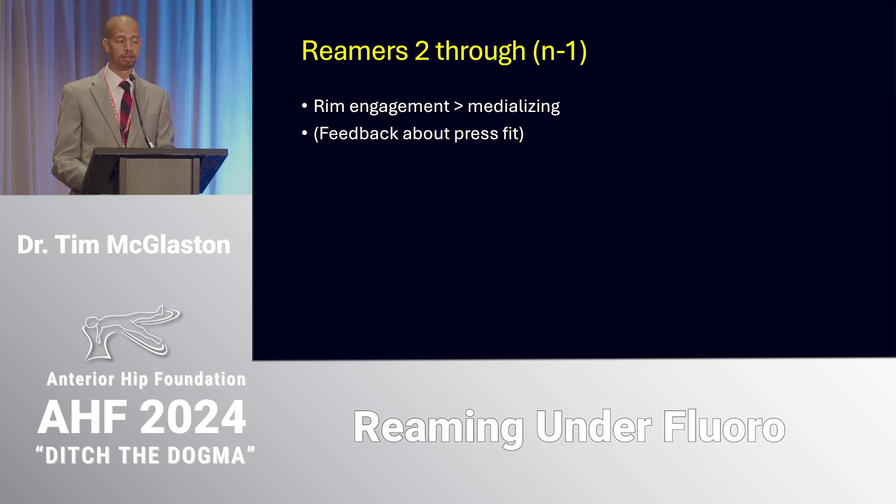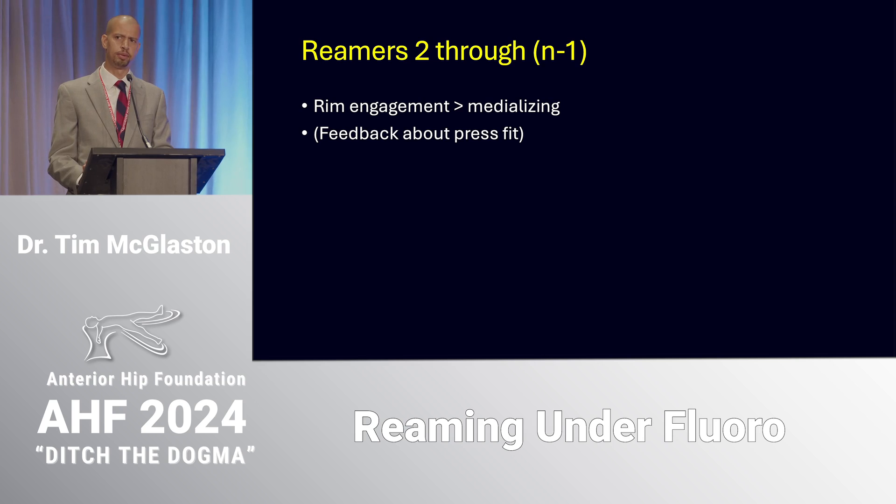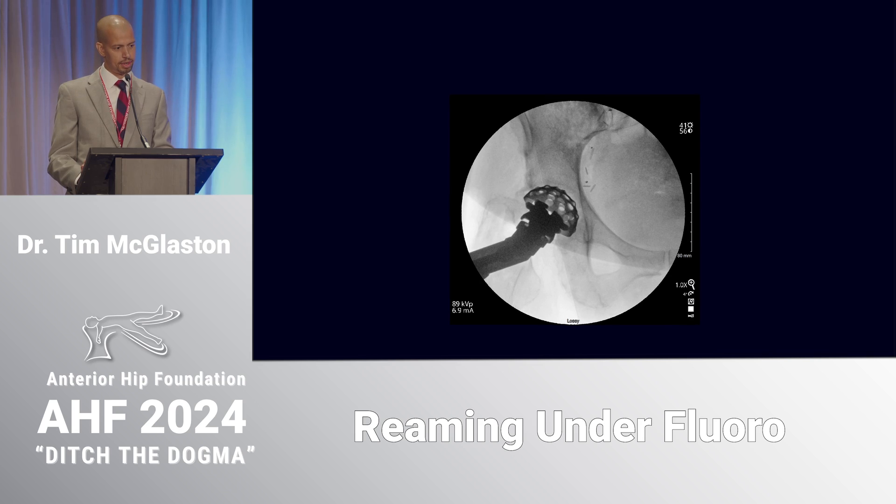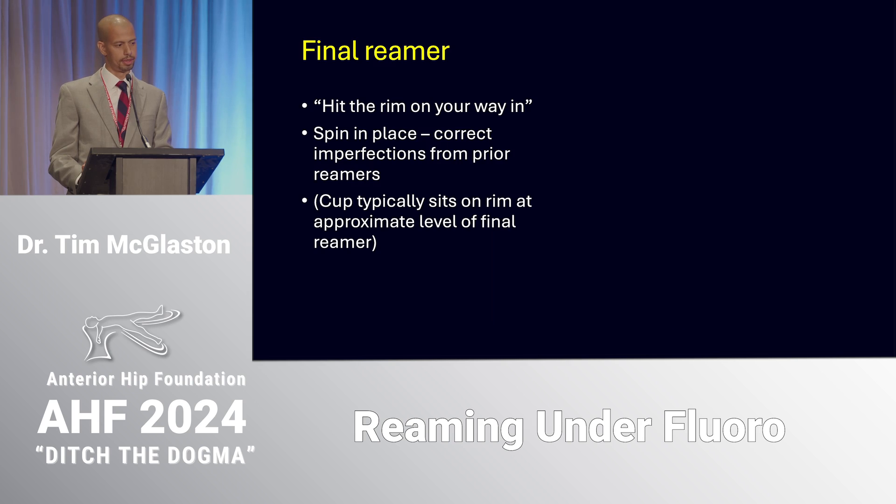That's where I start and where I end up after the first reamer. For the second reamer — which could be the final one — I'm reaming more to engage the peripheral bone and the rim of the acetabulum rather than medializing; I've already done the medializing with the first reamer. You can see a little halo between the border of the second reamer and where I had previously reamed with the first reamer, so I'm engaging the rim and medializing a couple millimeters — two or three.